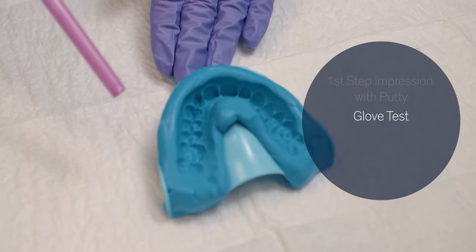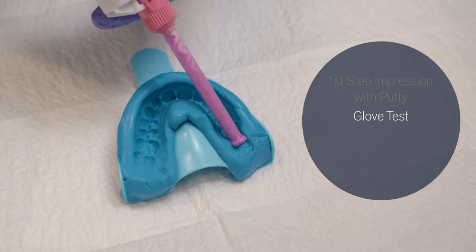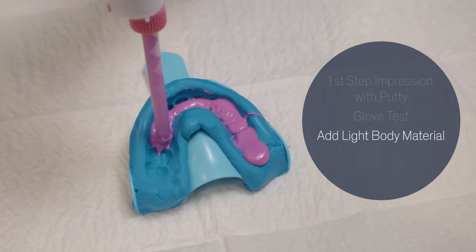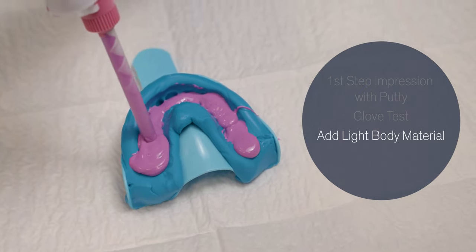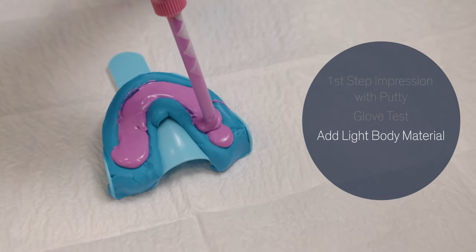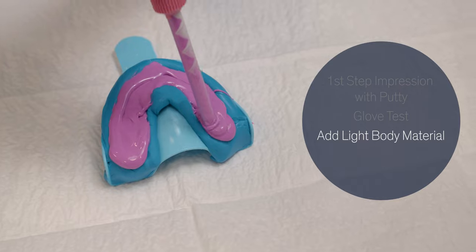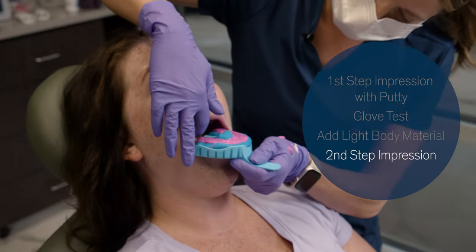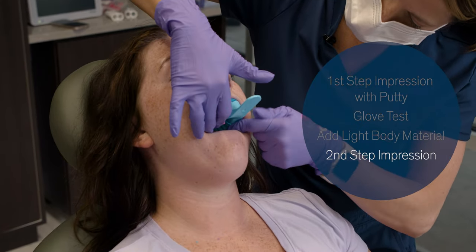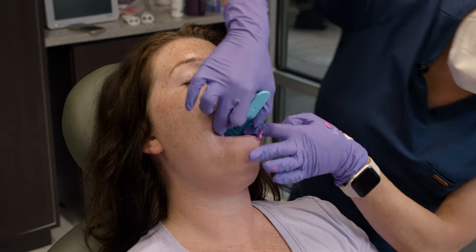Once we've taken our first impression with the heavy body or putty material, we will make sure the tray is dry and then inject with the light body material. We want to try to get the tip down into the teeth areas to help prevent any bubbles, and we'll inject light body material up to the top of the impression we captured. We do not need to worry about capturing the palatal area. Then we'll place the impression back into the patient's mouth, pull the lips out of the way, and fully seat the impression.